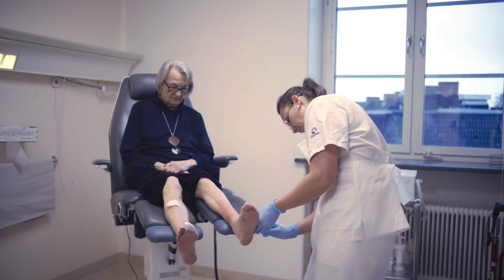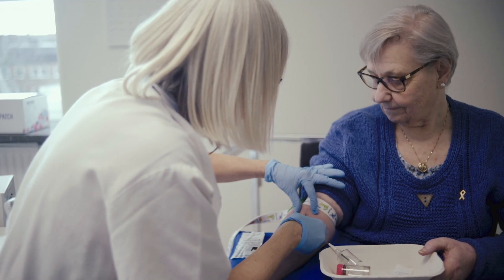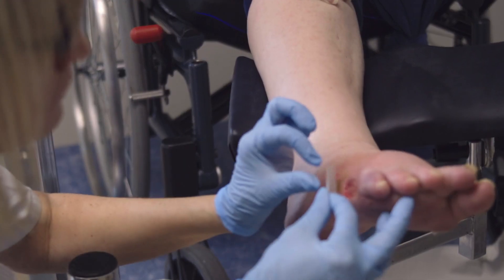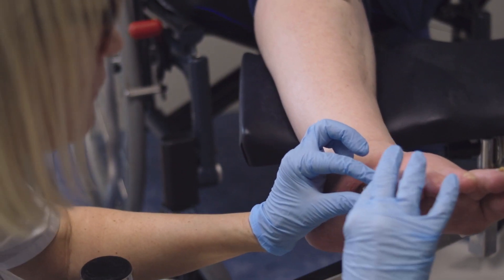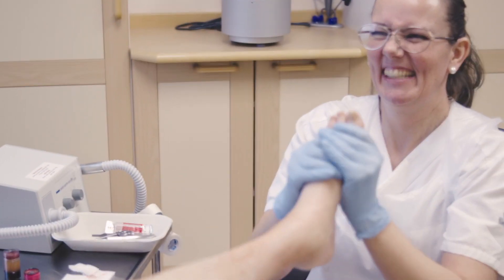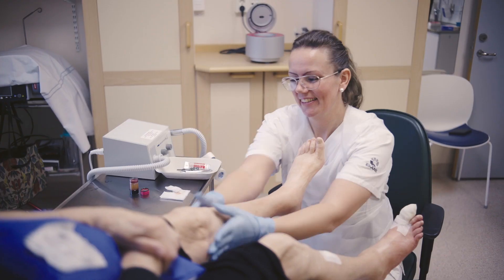It's vitally important that we do everything we can to help caregivers limit the devastating effects of hard-to-heal wounds on their patients. And by using the body's own capacity to heal, the 3C patch is clinically proven to almost double the chance of healing of hard-to-heal diabetic foot ulcers. For us, every wound is personal, and every patient counts.